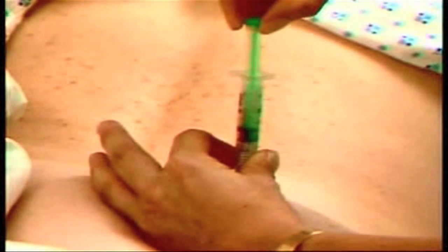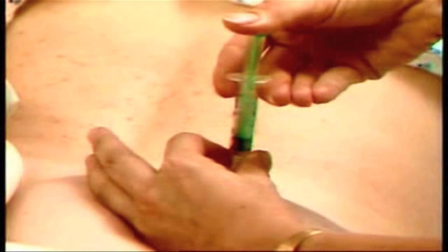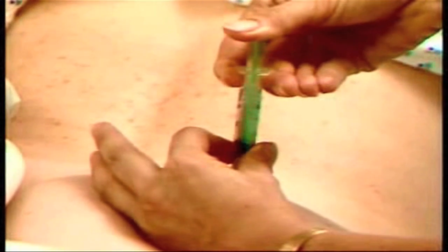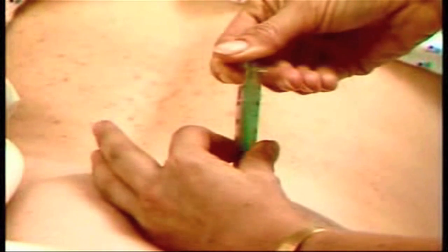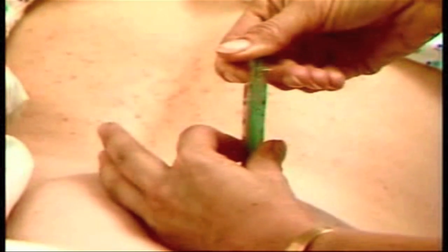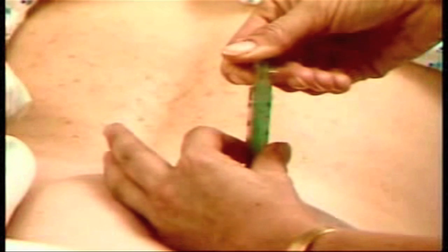Do not release tension on the tissue. Maintain the traction and inject the medication slowly. Wait approximately 10 seconds to allow the medication to disperse, then withdraw the needle and immediately release traction on the tissue. If there is any bleeding from the site, wipe the area with a dry cotton ball or gauze square. Avoid touching the blood. Do not massage the site afterward.